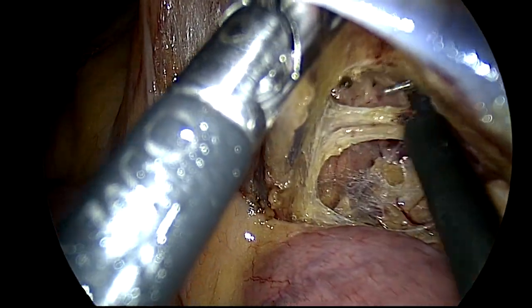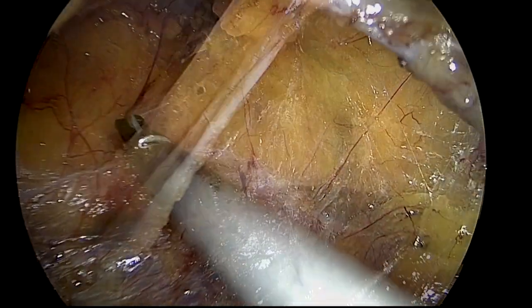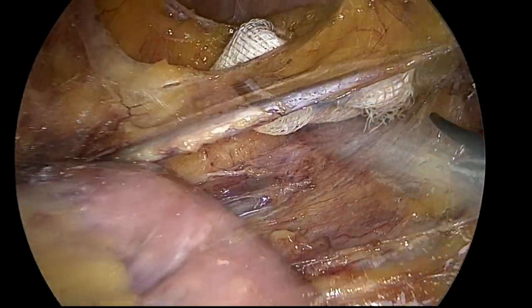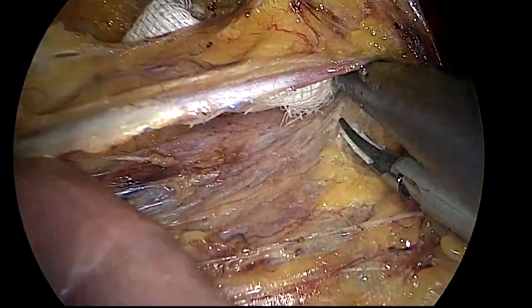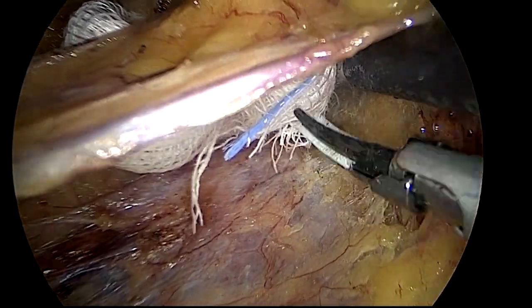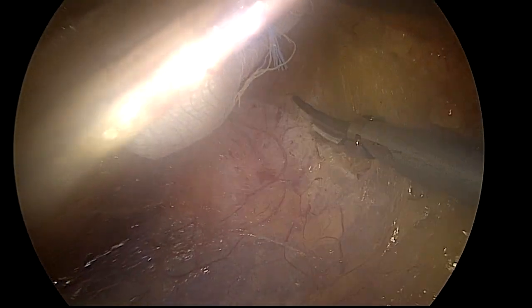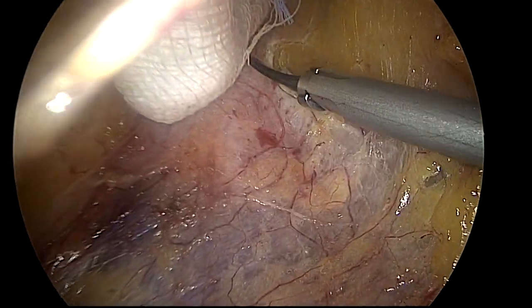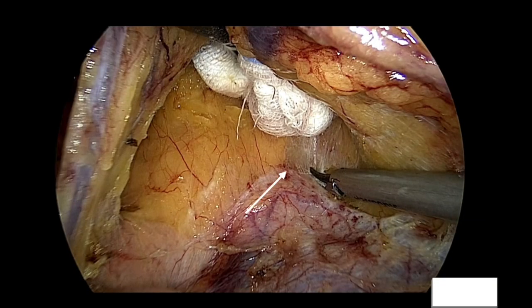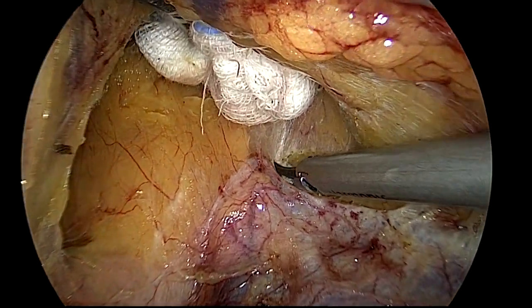One must be careful to avoid injury to the left ureter and gonadal vein if one goes too deep. The shiny surfaces and globular fat are two key landmarks to avoid this mistake. The edge of the Gerota's fascia is seen there, which will become more prominent as we proceed further. The dissection must stay above this edge to avoid venturing into the retroperitoneal structures.